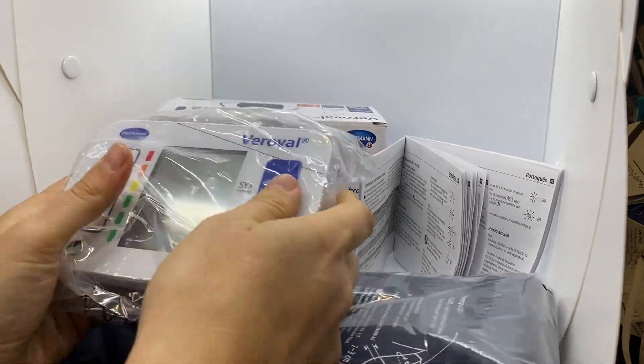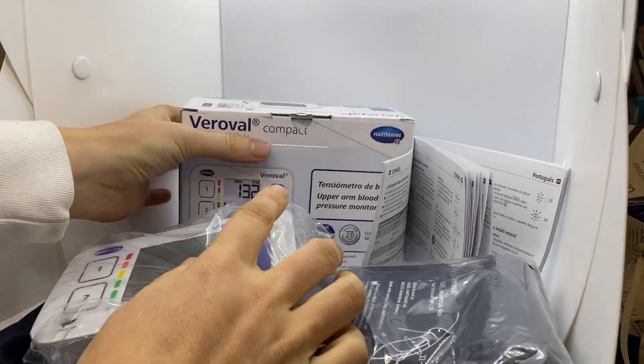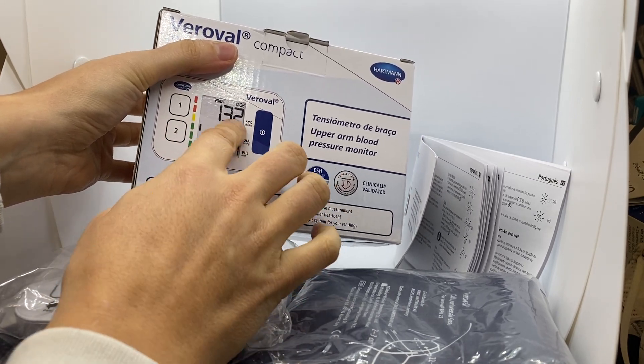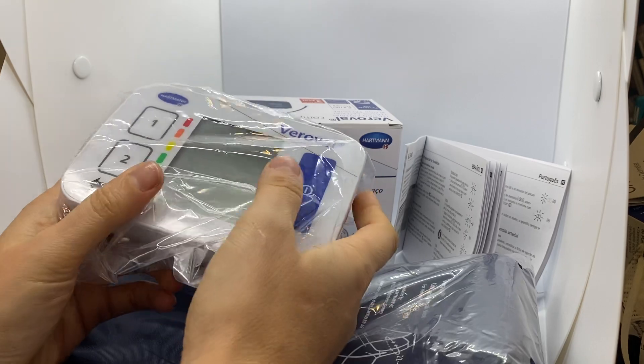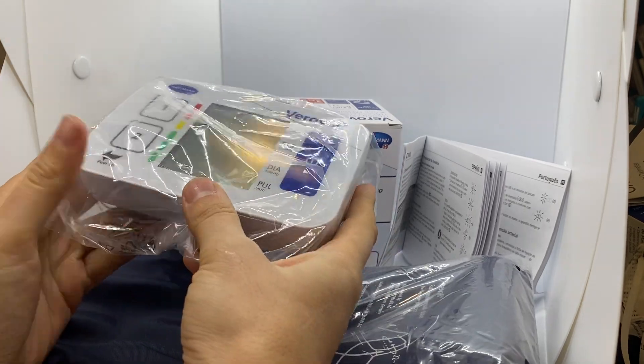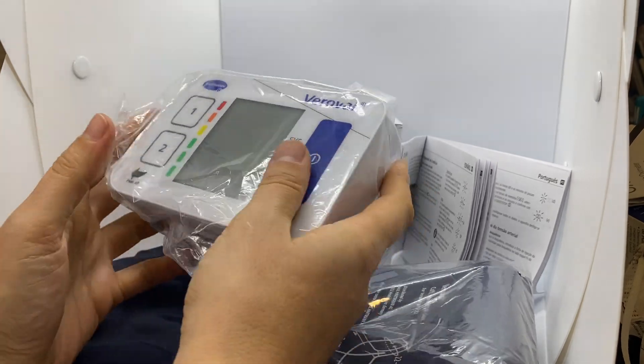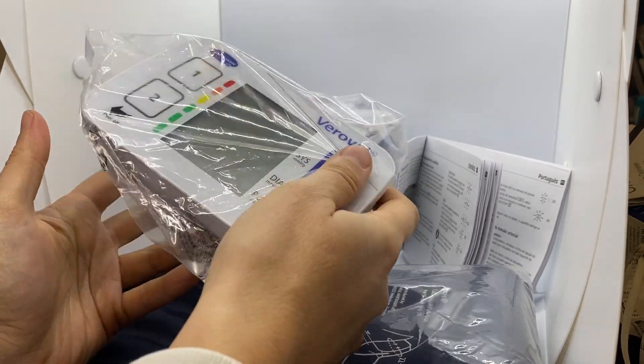It is very useful for older people because the numbers are very easy to read. It is very easy to carry because it's really light and compact.